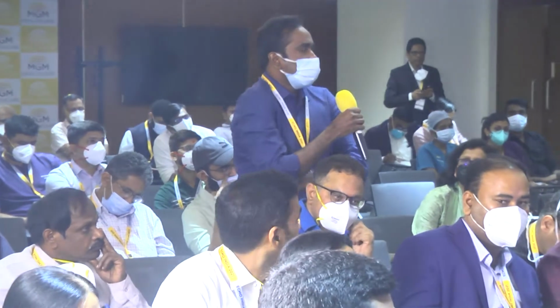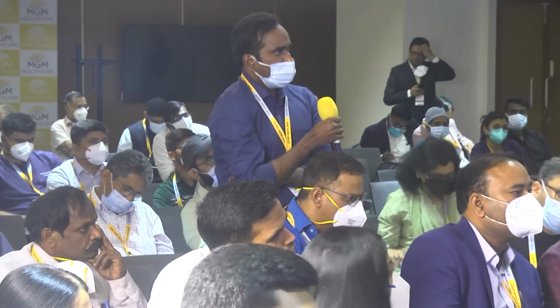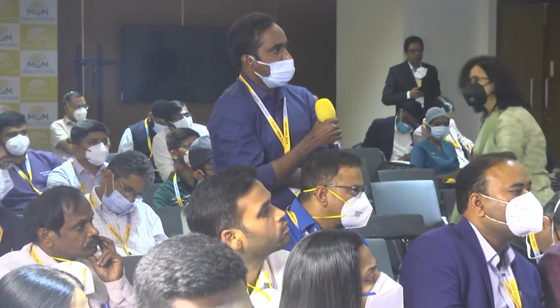Hello, sir. My question is, in case of ECPR, you are doing ultrasound guided arterial puncture, and you have mentioned that it is done without interruption of CPR. How is it possible to do that, sir? See, if you look at both things going on simultaneously, one is a team doing chest compressions and CPR, and a second team that is instituting the ECMO. So primarily, the chest compression should not be interrupted much. The chest compression should be continued, and ECPR, whether it is the cannulation or guide wire puncture, whatever it is, you have to do it with the minimal possible interruptions. It's not that you hold compressions for a full 1 minute, do the job, and then ask them to compress. No, that should not be done. Who needs to wait is the team doing the ECPR, not the team doing the compressions.